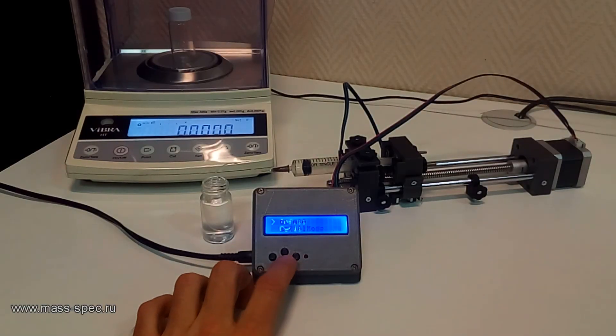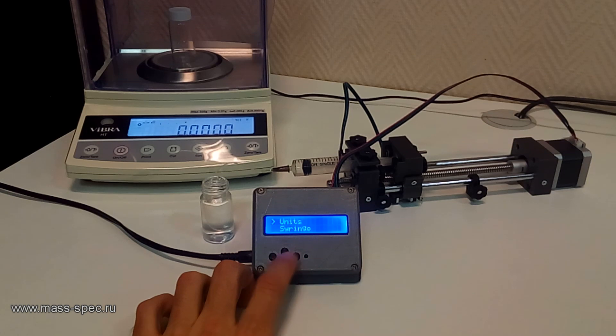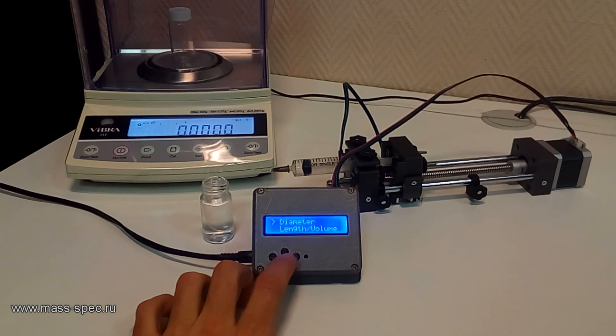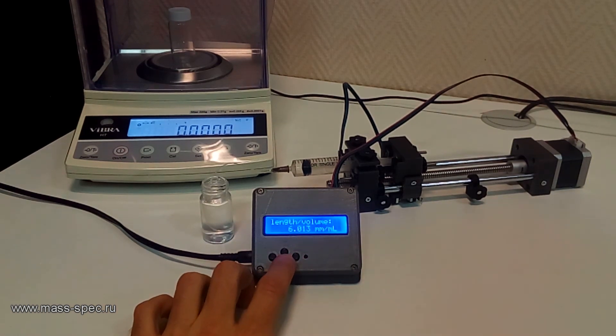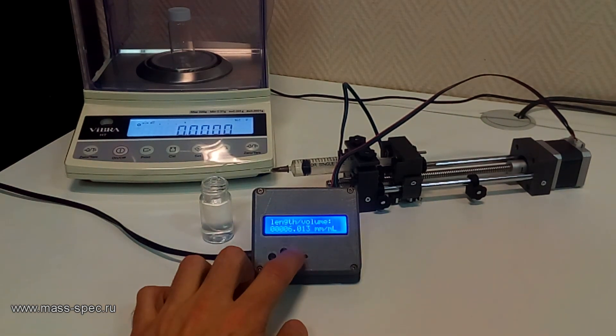To simplify further calculations, the length per volume coefficient of the syringe is set to 10 mm per milliliter.